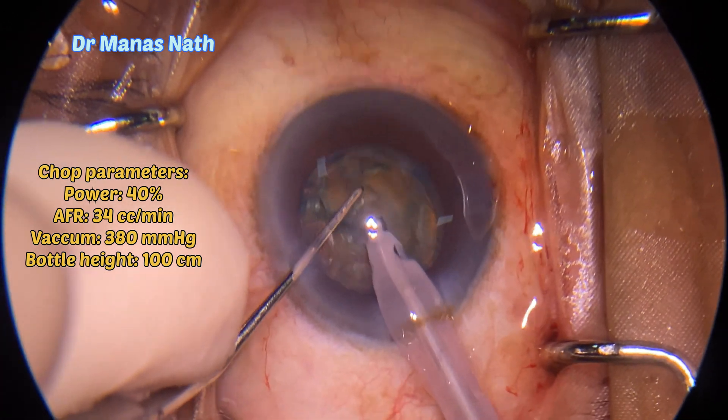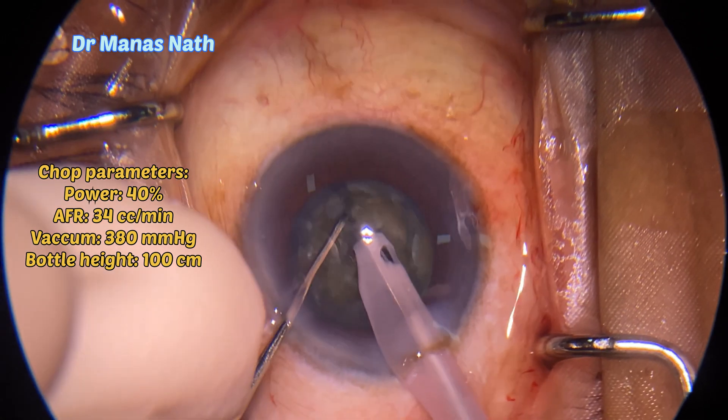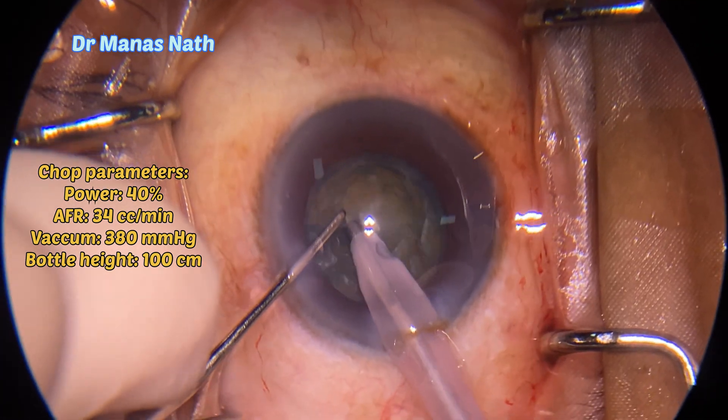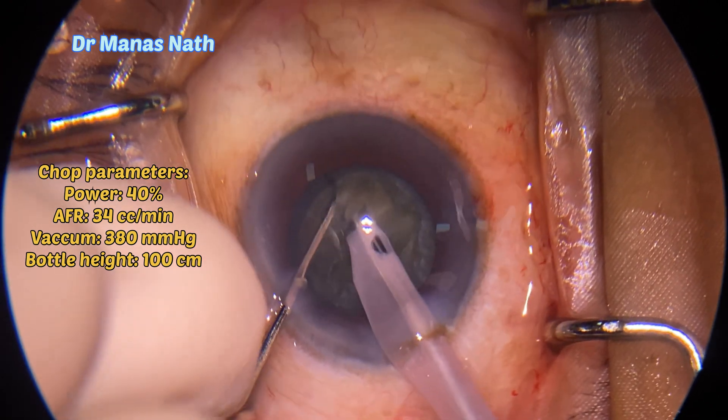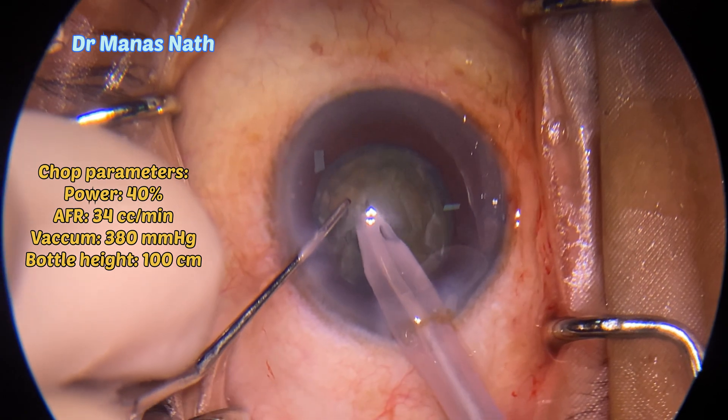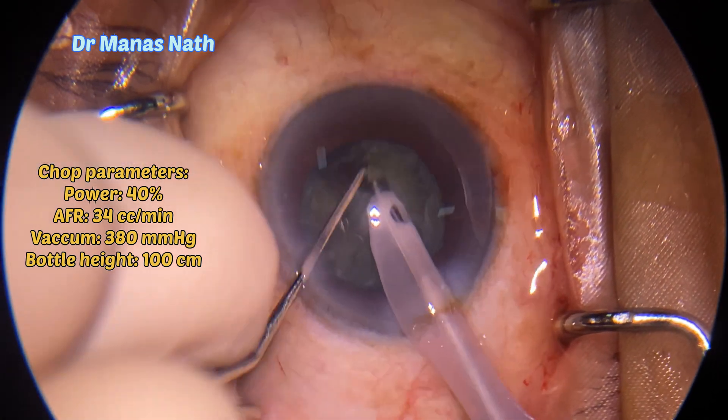As the cataract is on the relatively softer side, I have reduced the power, because too much power in the tip may impale through the nucleus and can pierce through the posterior capsule.